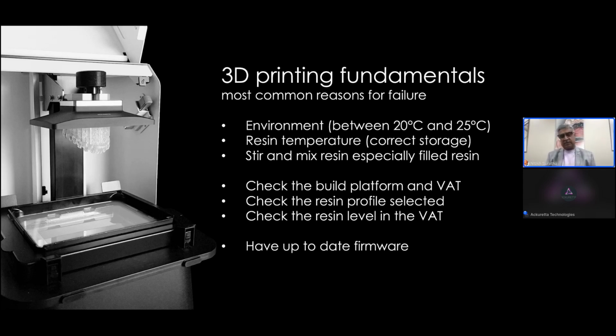With some resins, especially filled resins, it's important to mix your resins as well, because there's a supernatant and filler particles tend to settle at the bottom. With some of the resins that are compatible with the Ackuretta Sol, this isn't as critical as it is with some brands. With some brands of resins, I've actually had things like hot dog mixers constantly stirring a bottle in order to keep the homogeneity of the resin intact. You don't need to do that with any of the resins that are available for the Sol, but certainly a good idea to mix resin.